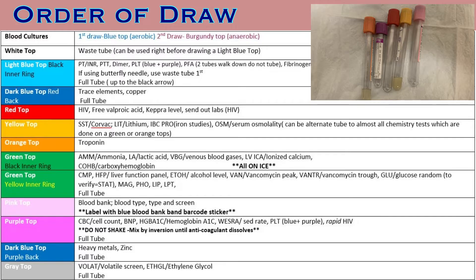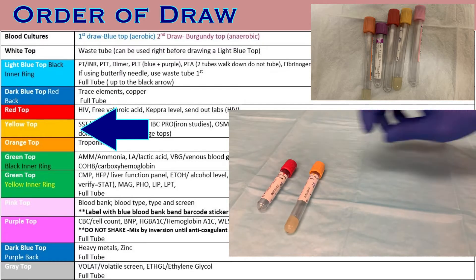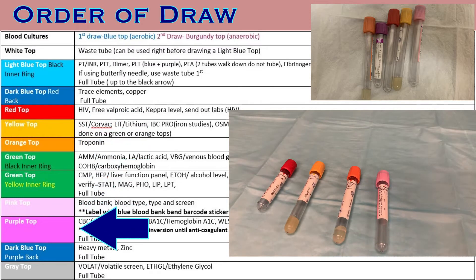Before poking the patient, organize the lab tubes in their correct order of draw to make collection easier and to eliminate the risk of cross-contamination of these preservatives. If you have this selection of tubes, you should arrange them in their proper order of draw, which would be red, yellow, orange, pink, and purple.